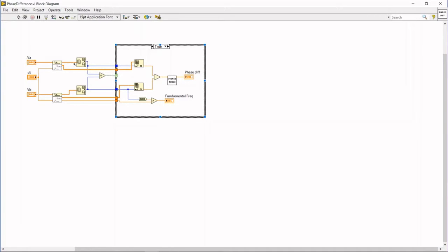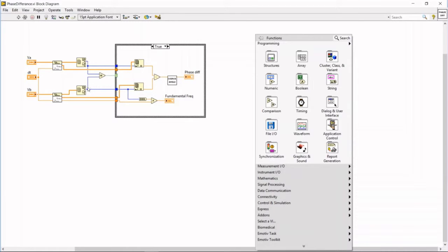So we are taking this function that calculates minimum maximum of the array and compare it with the VB maximum of amplitude spectrum. When we know that frequencies are the same, we're going to use that so we can extract the phase from that frequency with index array function again. And when we do that for VA and VB, we can subtract those two values and get our phase difference. That angle can be anything, so it can go over the range from -pi to pi. So we're going to use this function to set it in that range.